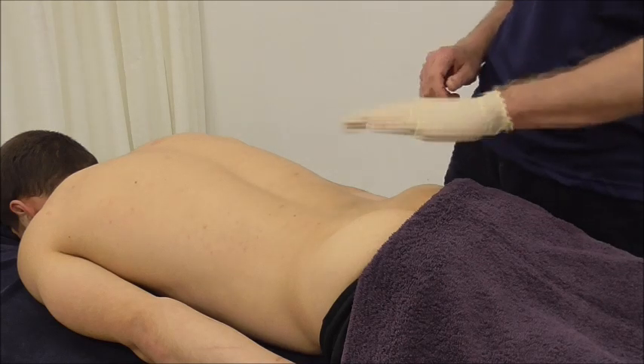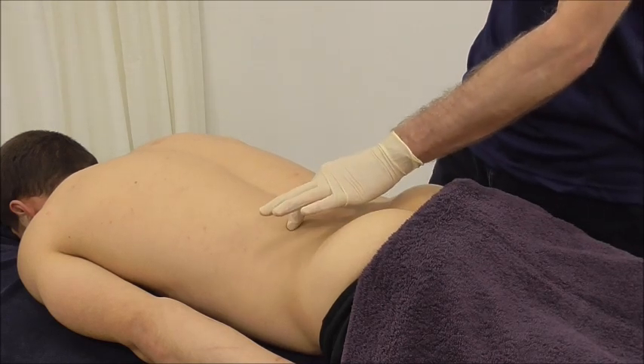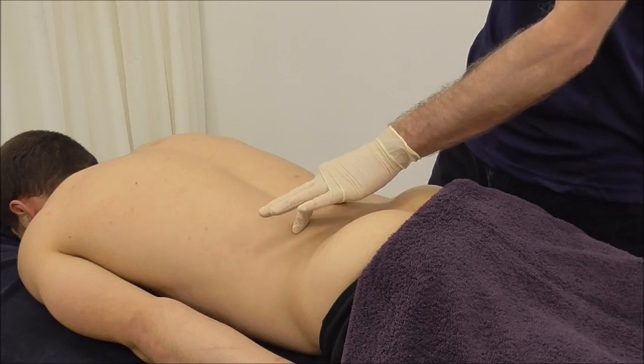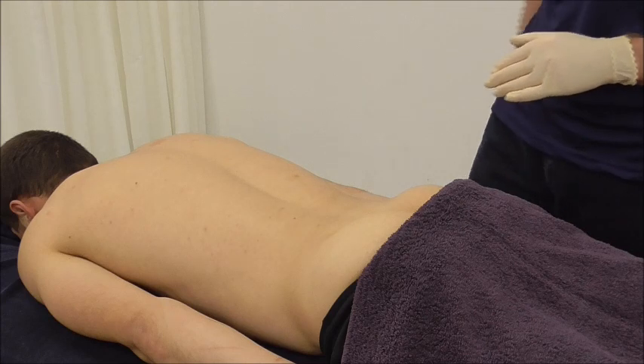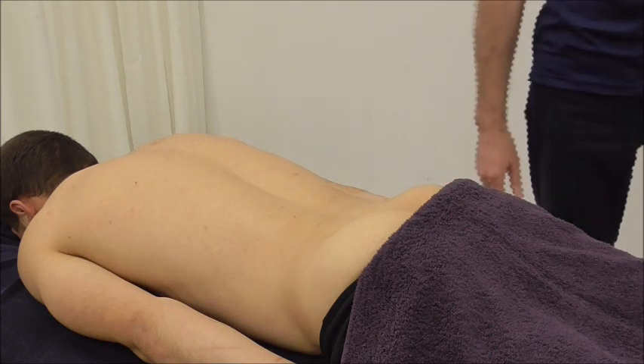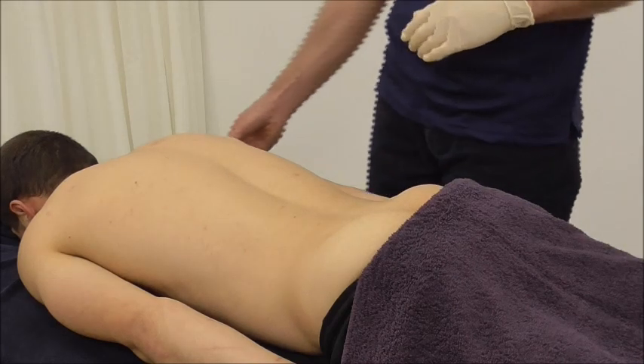We're going to look at two techniques: a multifidus technique and the most common erector spinae technique, which is to the longissimus itself. We'll start off with the longissimus because it is one of the more common ones.